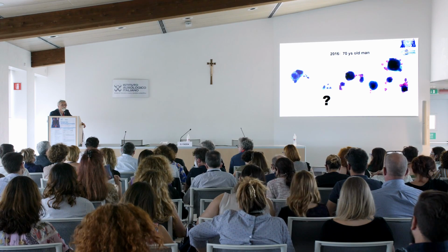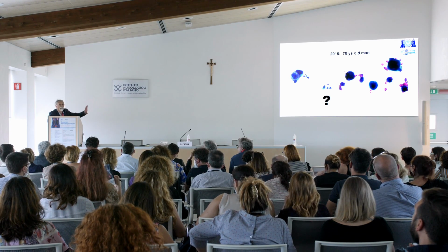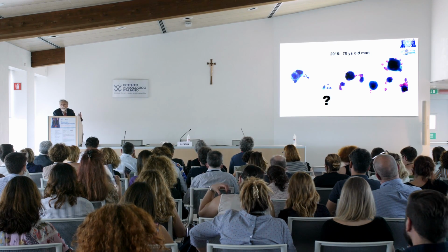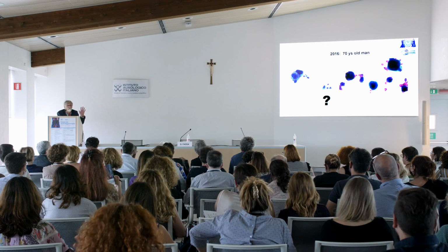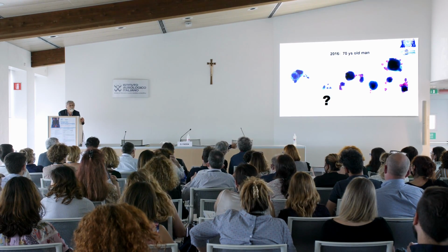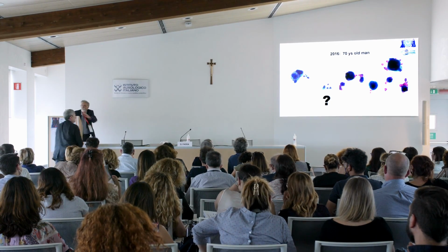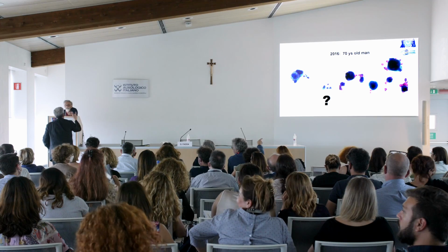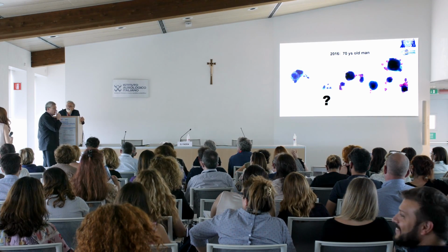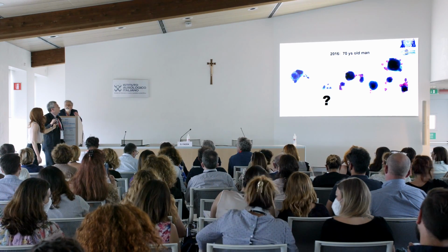It's difficult to make a diagnosis on one cell, even if it is suspicious. Five cells, I think. Do you agree? So three similar samples. My first impression is that the technique is not optimal.